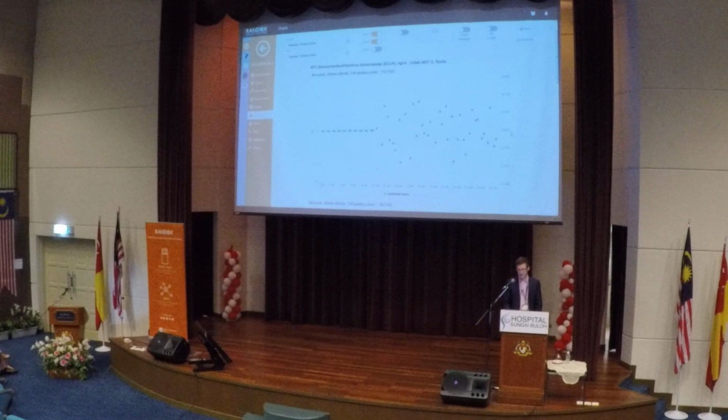And on these graphs, on the right-hand side, we have the right-hand y-axis, where we can see the actual concentrations as well. So 13.073 is our target value from our own established running mean. And then we can see our positive ranges and negative ranges above and below.